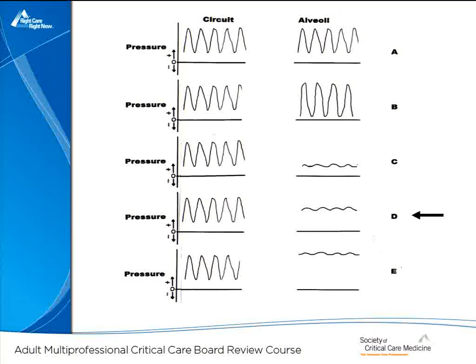And the wiggle isn't enough to provide convective flow ventilation, but the wiggle is enough to invoke different forms of gas movement up and down the tracheobronchial tree. Oxygen does go down, CO2 does come up. So the correct answer is CPAP, or CPAP with a wiggle, and the mean pressure in the alveolus generally is similar, if not identical, to the mean pressure in the circuit.